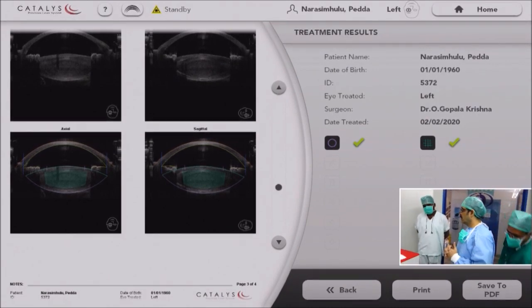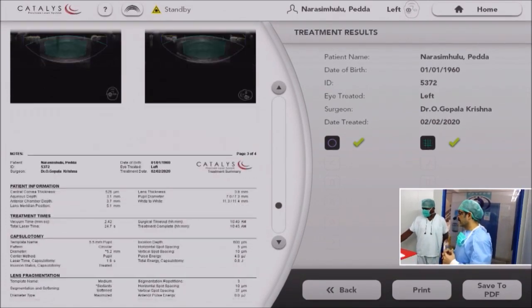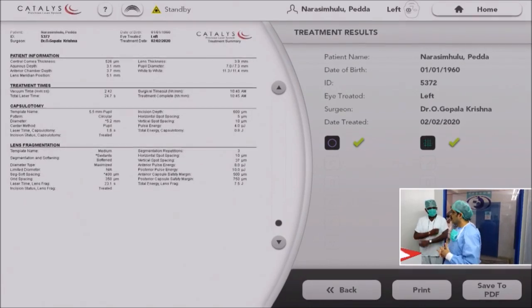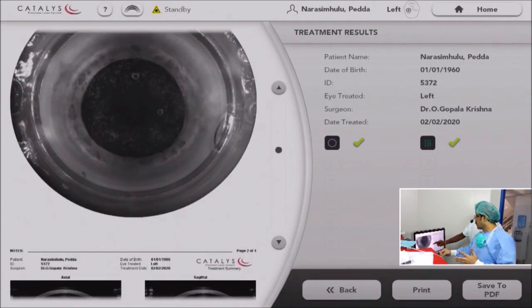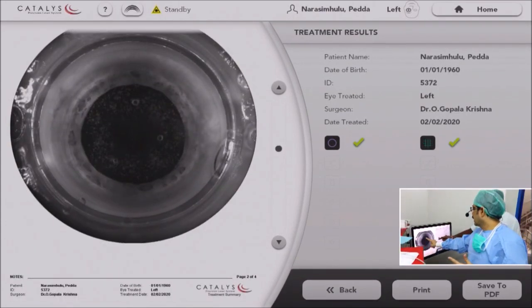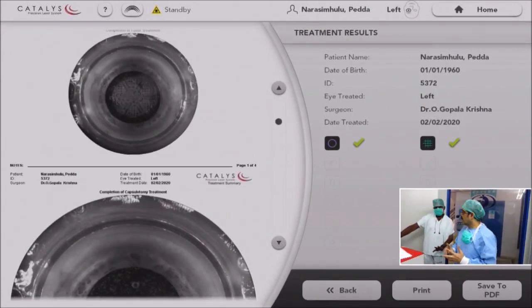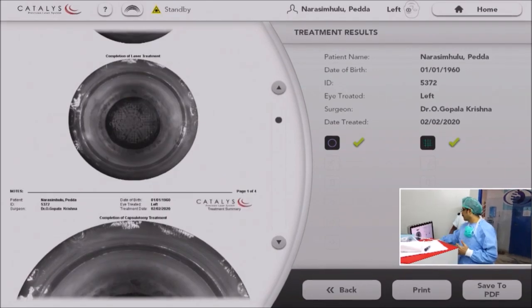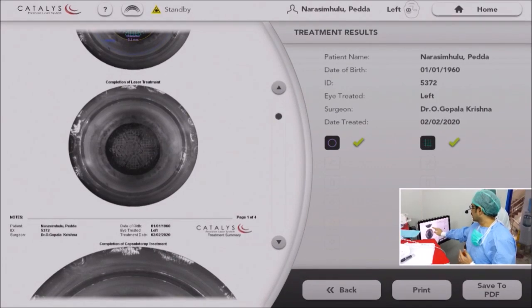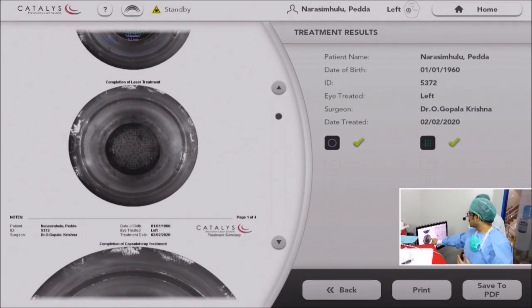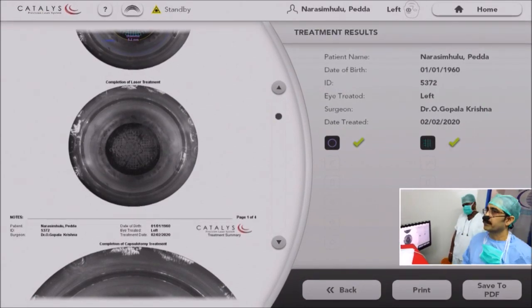Post cracking, can we see the cracks in a similar OCT picture? Post cracking, we will not be able to see the OCT. But the bubbles came out — that itself indicates that the laser was delivered properly. The bubbles came through the anterior capsule area and underneath the anterior capsule, which shows the laser was delivered. The picture will show on the monitor — the completion of laser treatment. That's the end point. You can see on my monitor the six quadrants, then small cubicles, and some amount of air bubbles in the anterior chamber.